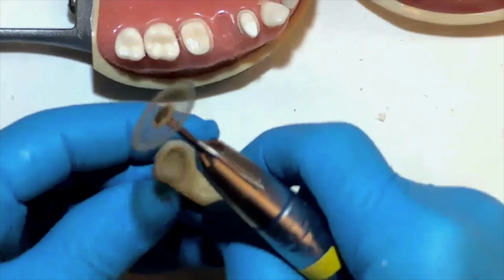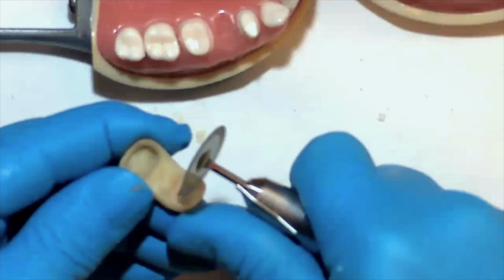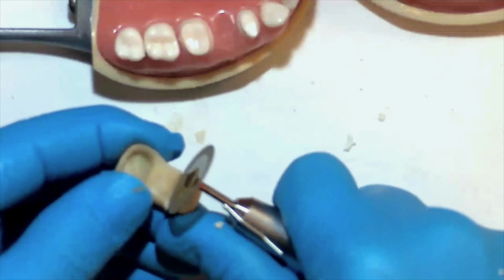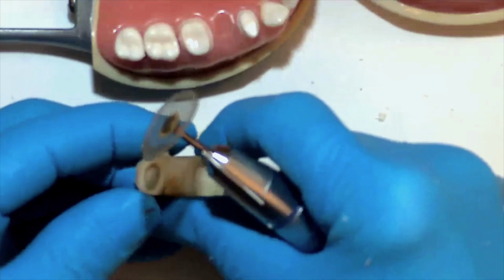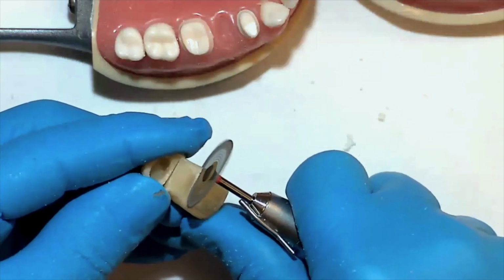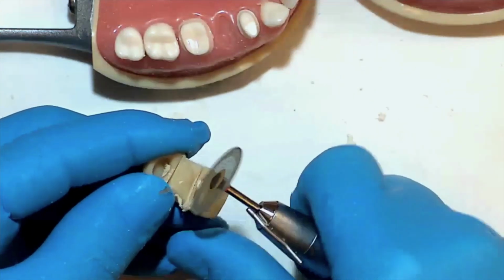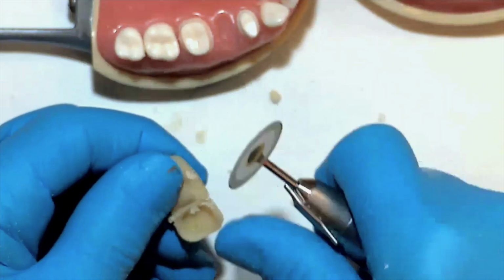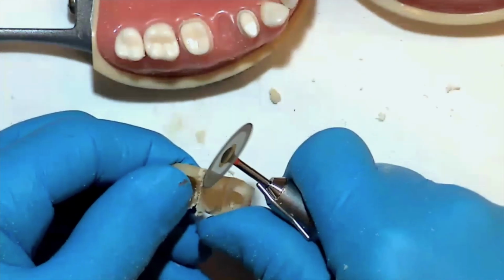Now we're going to go to the underside and begin to separate the three teeth by creating the interproximals, the embrasure areas, starting on the bottom because we have a good landmark there. By angling the instrument mesial and distally, you can create good embrasure contours for the papilla.